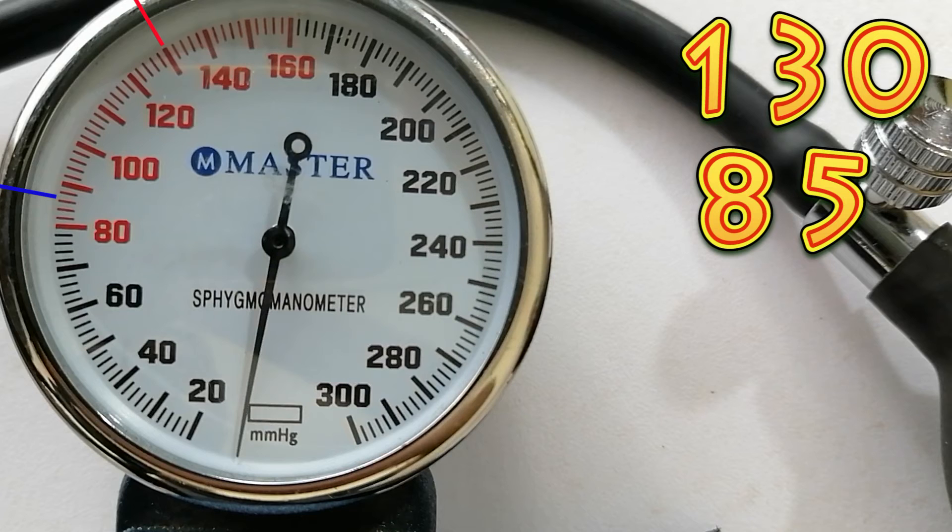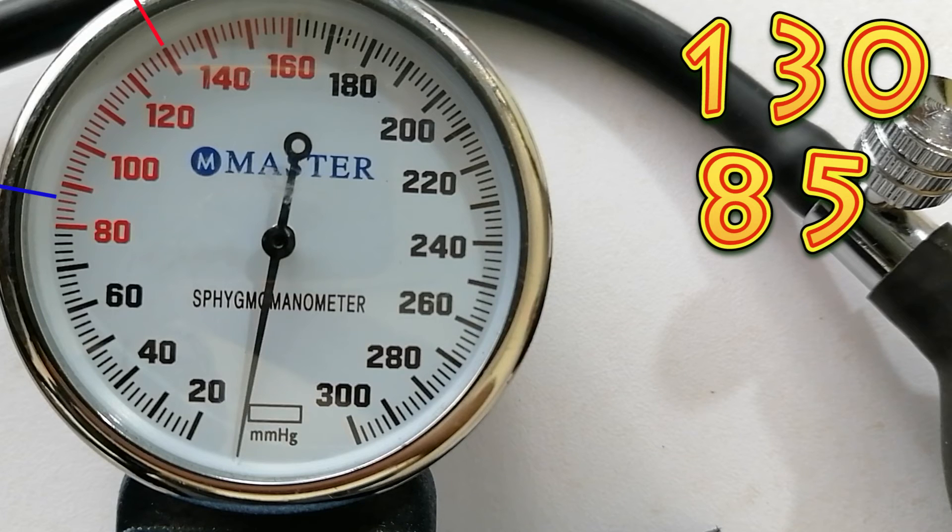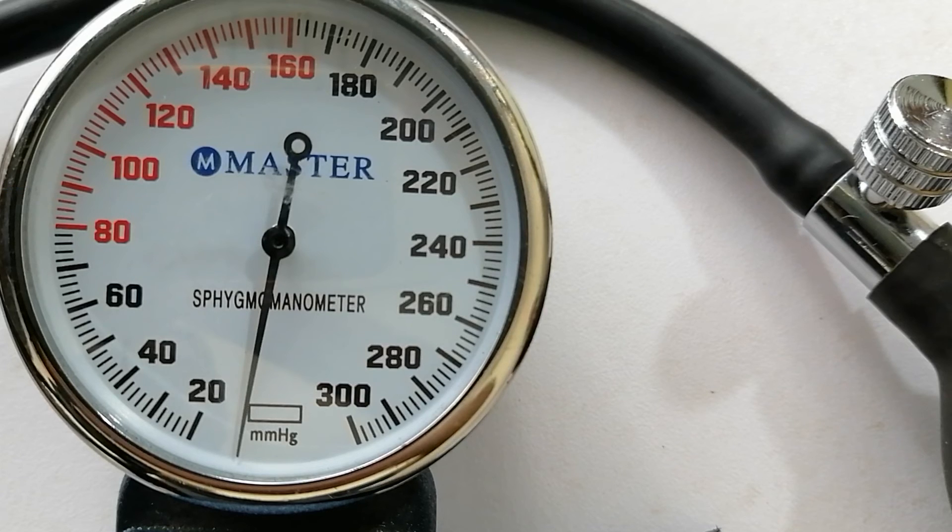The first time we heard a throbbing sound was at 130, so our systolic blood pressure is 130. The last time we heard a throbbing sound was at 85, so our diastolic blood pressure is 85. We tried to explain this to you in a very simple way.